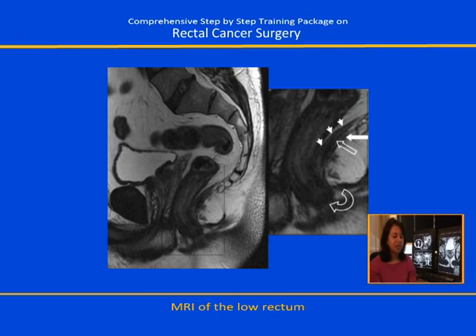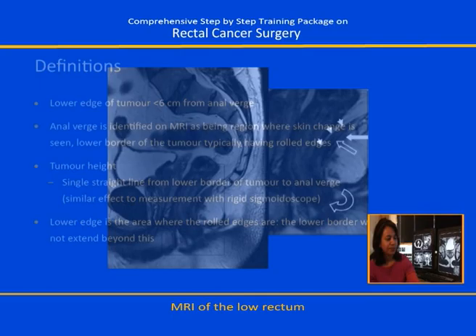And that's the big shift in how surgery is planned, because I think in the past these decisions were made when the patient was anaesthetised at the time of surgery, which hopefully will become a thing of the past. I think that hopefully you'll be able to see exactly what you're dealing with ahead of actually going to theatre.